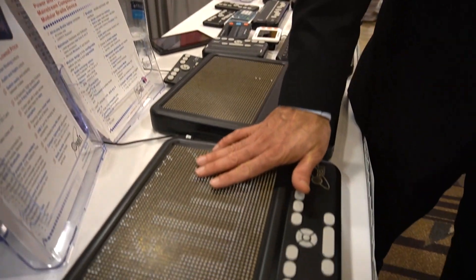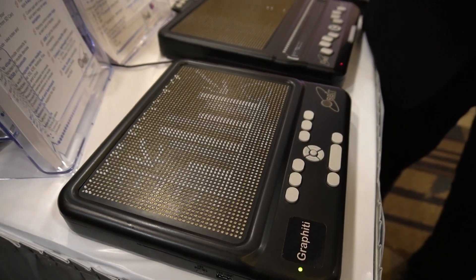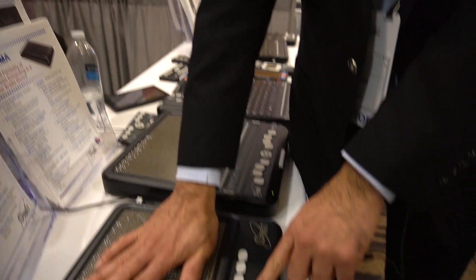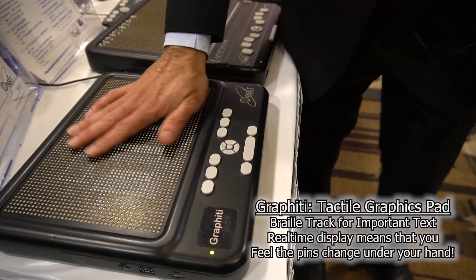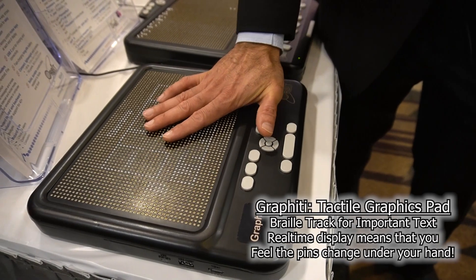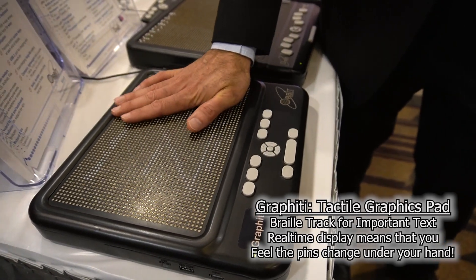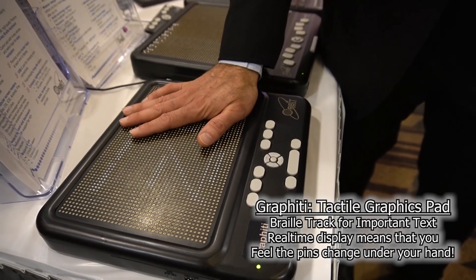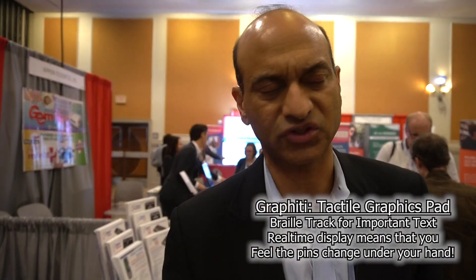You're separating them yet keeping them under one device. Exactly. Another key feature is that the pins are actually two millimeters tall, so it's very easy to perceive the graphics, and you can keep your hand on the display while it's refreshing — you don't need to lift your hand because the pins are strong enough to move your hand up. This allows you to really see those changes in real time versus lifting your hand and trying to figure out what changed.